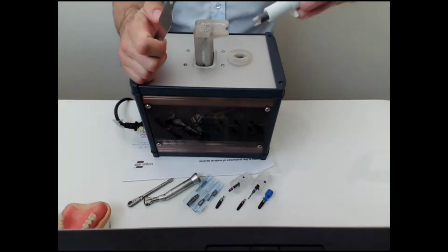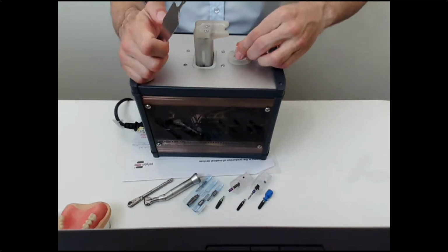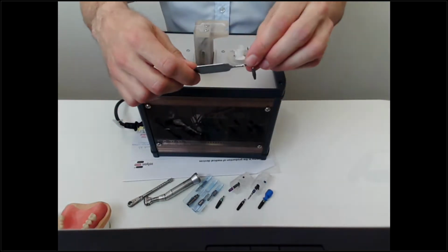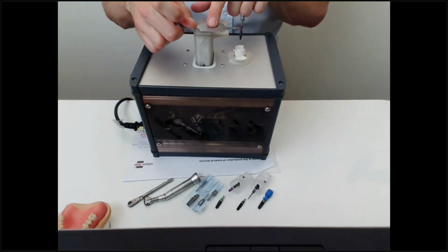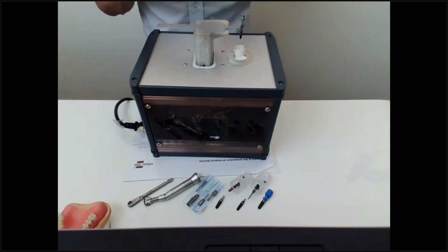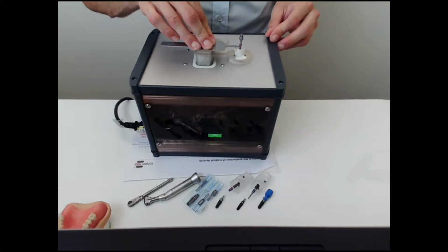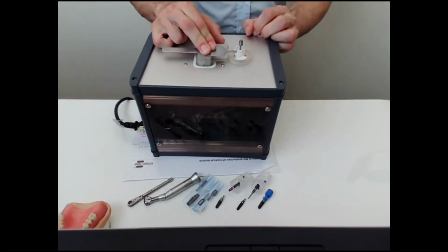The user can select the correct reactor and insert it in the device. Afterwards, he has selected the implant with the sterilized transfer tool and the sterile implant. You can put it on the device. I think it should be switched on. And then you just put it into the reactor, and the activation will start.